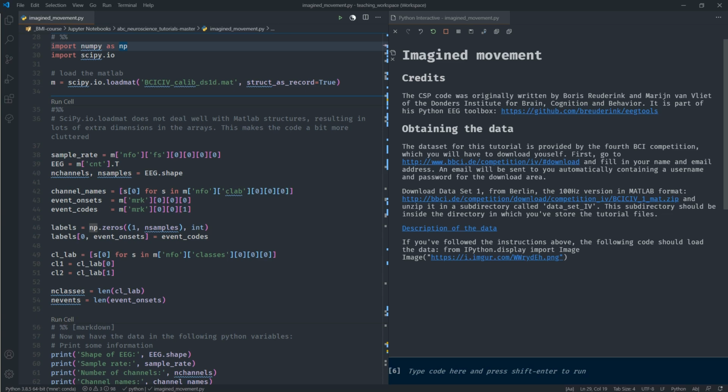Such a decrease in the EEG mu band is called event-related desynchronization, or ERD in short. If we measure the amount of mu activity at different locations on the motor cortex, it is possible to determine which limb the subject is moving. Through the mirror neurons concept, this effect also occurs when the subject is not actually moving his limbs, but merely imagining it. This is a very important finding for BCI.